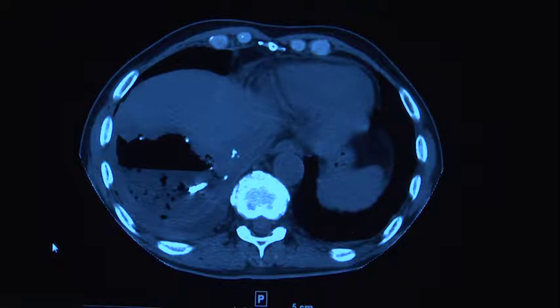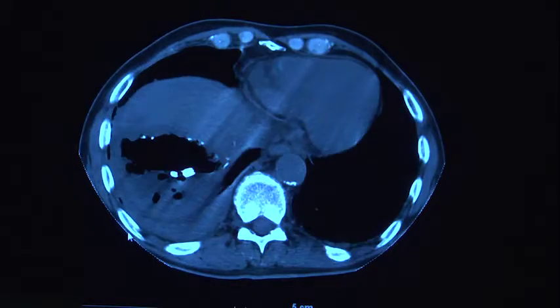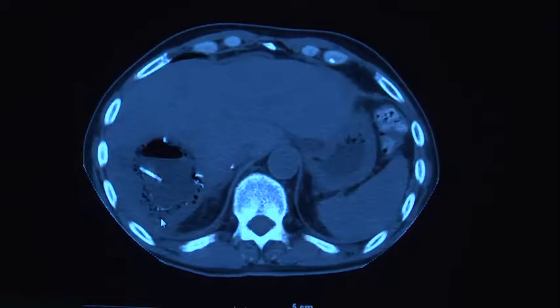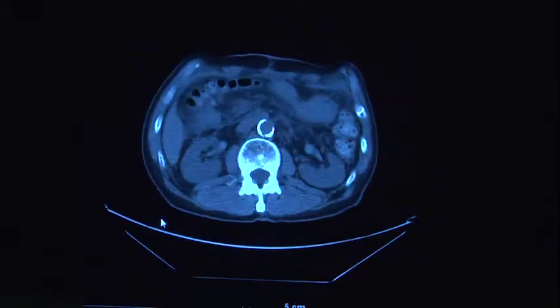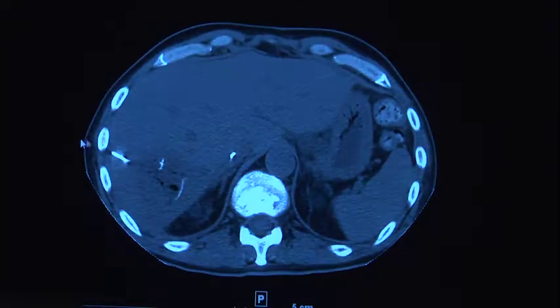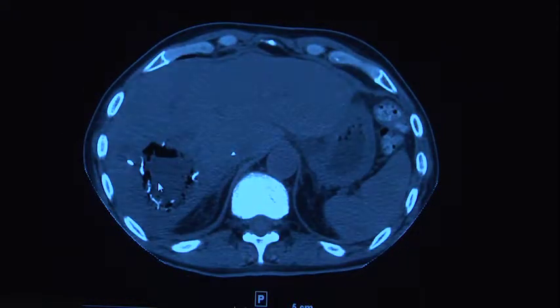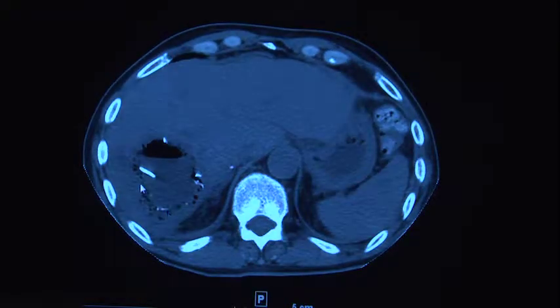Dr. Patel placed a hepatic or liver abscess drain, because this infection if left untreated could be fatal. What was done is you were re-imaged just like you're done here but without contrast, and then a needle was directed by Dr. Patel through the body wall here into the lesion. These images show this white line, so he came from the side into the lesion.